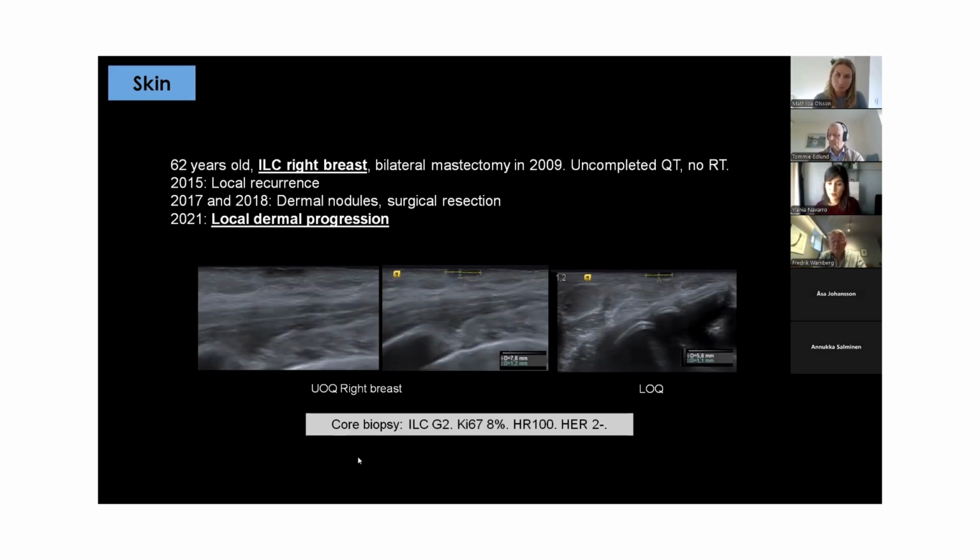We confirmed with the biopsy that they were metastases from the lobular carcinoma. So this patient already had multiple surgeries because of the multiple recurrences, some of them very aggressive surgeries. So by this time, we decided to try to treat these lesions with cryoablation to avoid her another surgery.